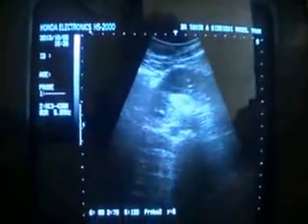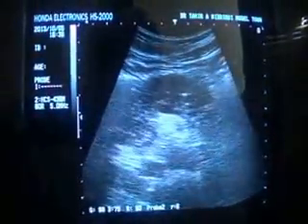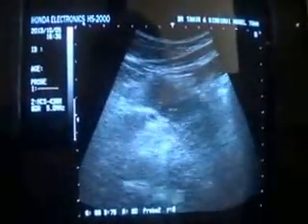Now this is the patient whose pancreas we were scanning, now in standing position — it becomes more easy to see the pancreas as the organs come downwards. I will place the probe here in the epigastric region and then maneuver it in this direction. This will be the scanning time and we will try to see if we can get the same findings. Now on this screen you can see the pancreas with multiple echogenicities occupying all of its current diameter.